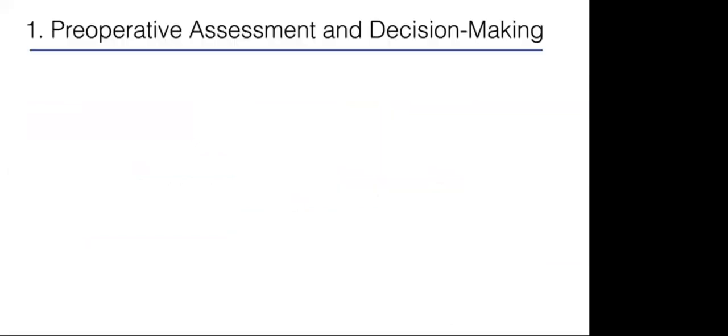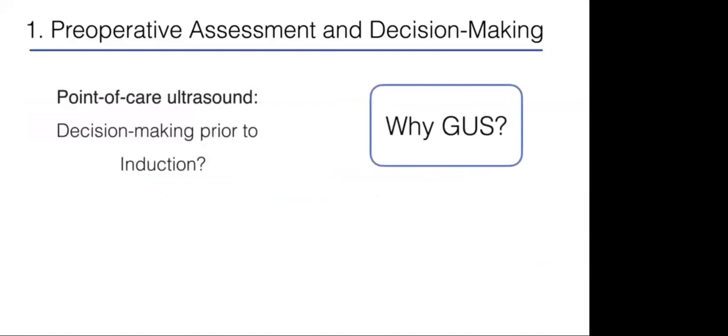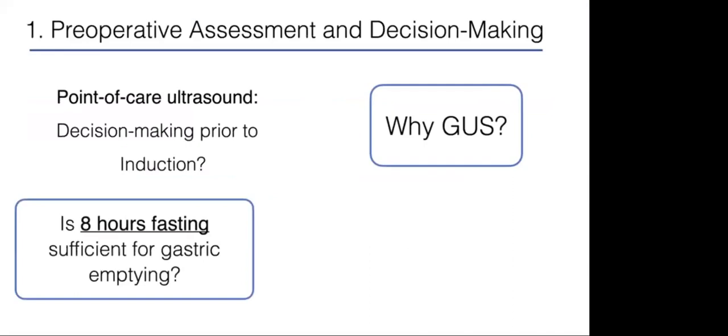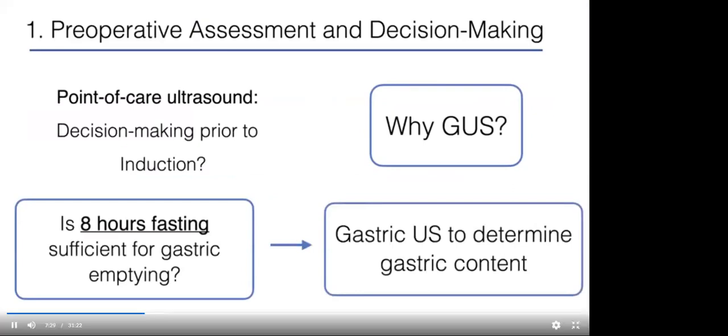The first question in decision-making is why gastric ultrasound? Any good prior to induction? Is 8 hours fasting sufficient for gastric emptying? And my answer is that gastric ultrasound can help us to determine the gastric content, regardless of the hours of fasting and many other conditions.